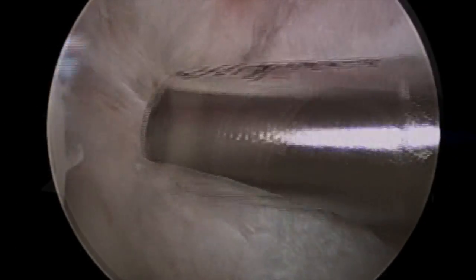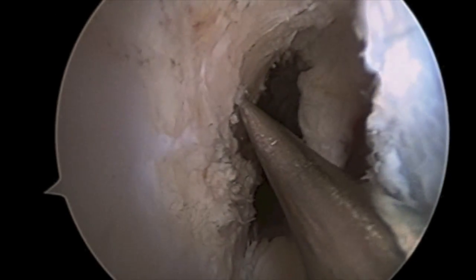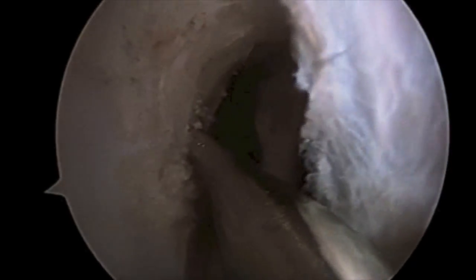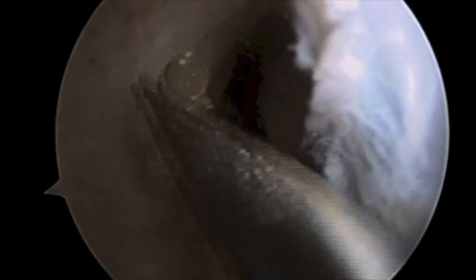An arthrocare wand is utilized to clear the femoral wall for assistance with femoral footprint visualization. A microfracture awl is then inserted through the medial portal of the knee and used as a marker to mark the femoral wall at the point where femoral tunnel placement is expected to be performed.